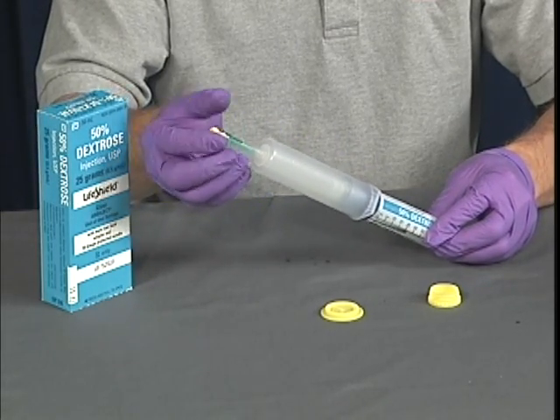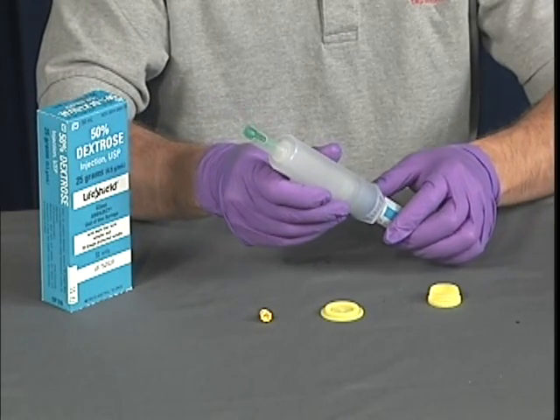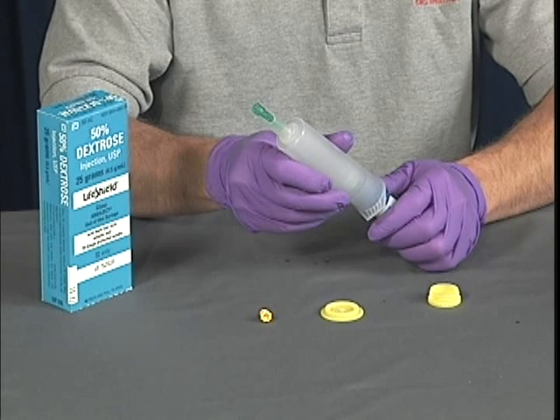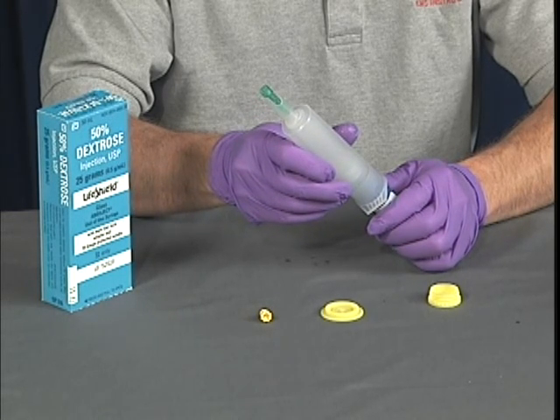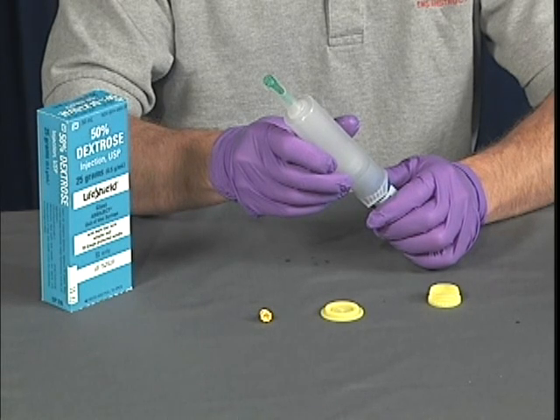With the unit now fully assembled, remove the distal cap and gently depress the plunger until the air is expelled and only the desired amount of medication remains in the syringe. The medication is now ready to be delivered.